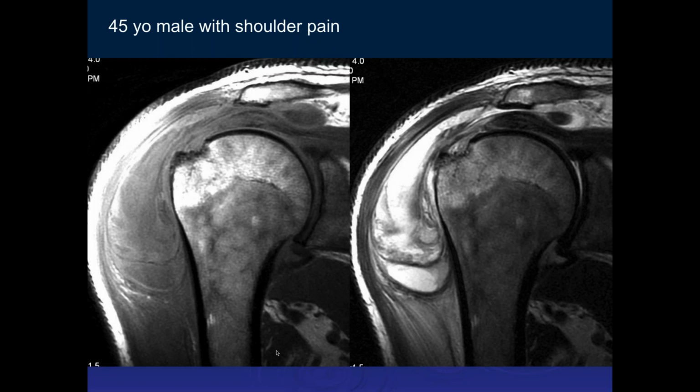So there's a large amount of fluid in the subacromial subdeltoid bursa, and the tendon looks like a near or almost full thickness tear of the supraspinatus. When you say almost? Yeah, it's full thickness. Okay, how do you know definitively that it is full thickness? Just because the tendon looks retracted, and there's also, I guess, fluid.